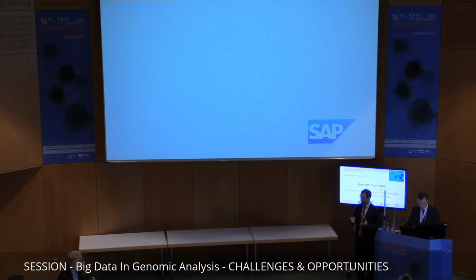The test that we're doing is the entire coding region of 300 genes. So across the genome, there's going to be a lot more variants of unknown significance. I think the genes on our test cover everything that's currently known to be clinically relevant. So those recurrent known mutations won't increase in number by increasing the size of the test. I think the real meat of your question is how many of those are clinically actionable. There are drugs for them.